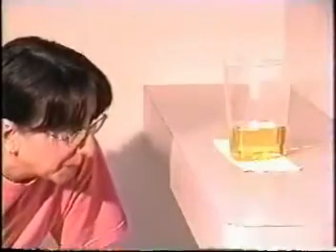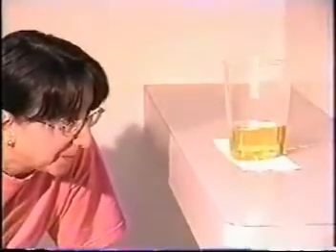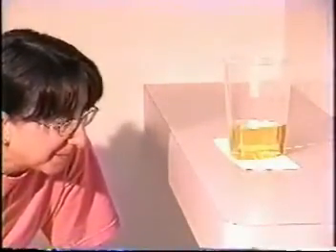Measure the urinary output at eye level on a flat surface. Observe for color and consistency and make a mental note of your findings. Discard of the urine in the toilet. Remove your gloves and wash your hands.